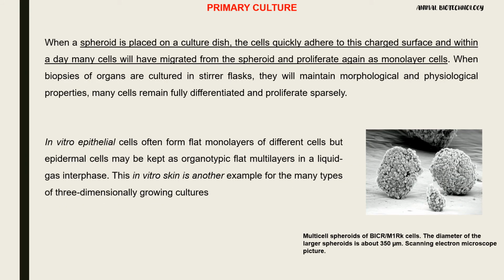The three-dimensional spheroid cells, when cultured in normal culture dishes, can proliferate again and form monolayer cells. The figure below shows a three-dimensional multi-cell spheroid.